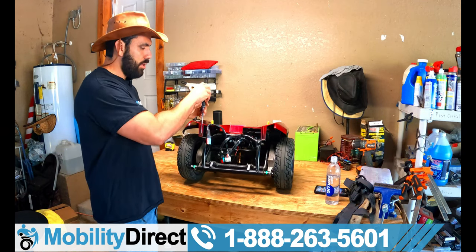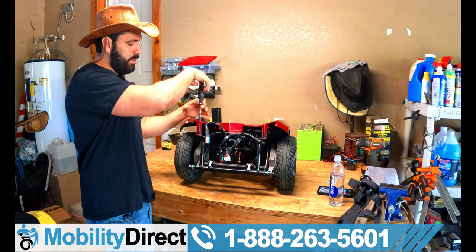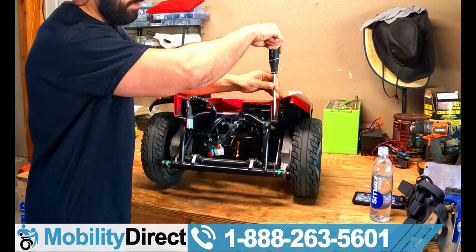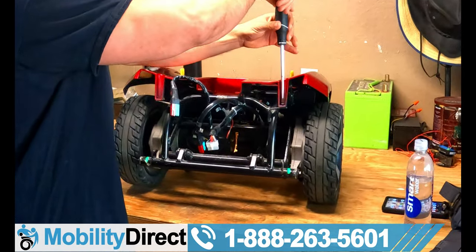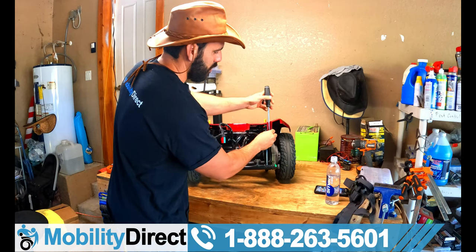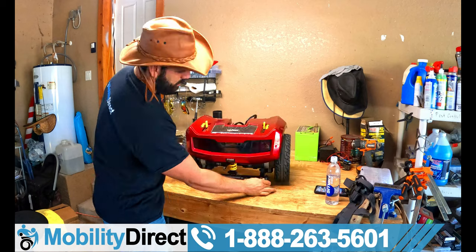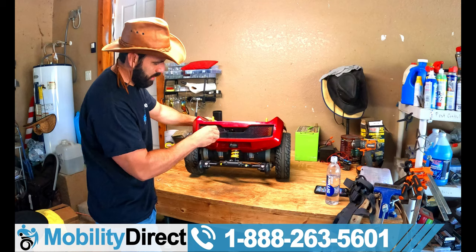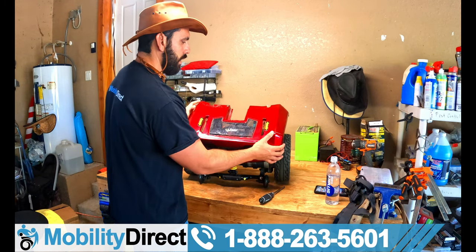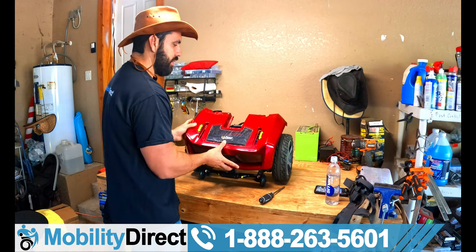I've got my Phillips head screwdriver. There are two screws to start with right here and right here. The first thing we want to do is take this body panel off so we can have access to the motors. Those two are off, and now I'm going to work on getting the rest of the screws off so I can take the whole panel off. There are two more screws in the rear. When you're removing this body panel, be careful because there are rear lights attached to it with connectors you'll need to detach.